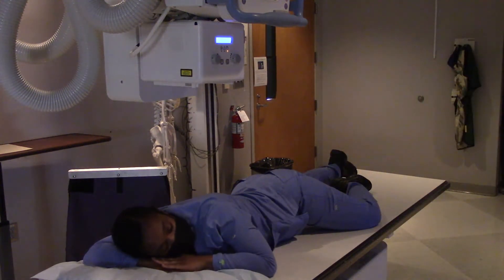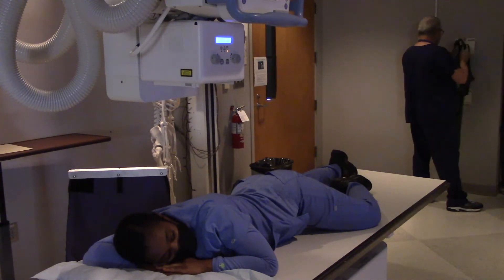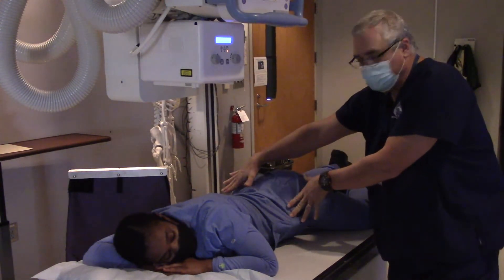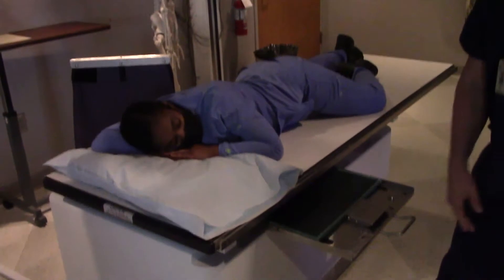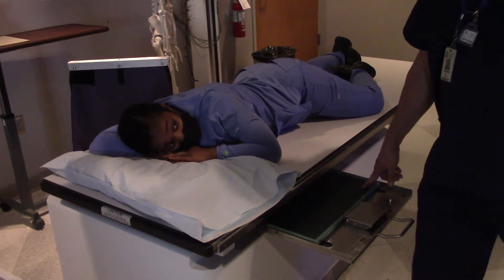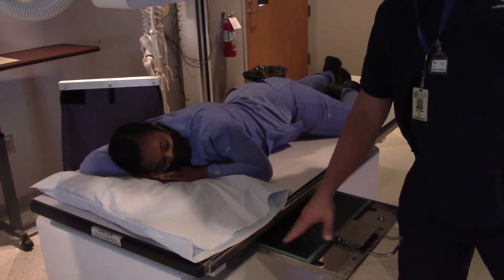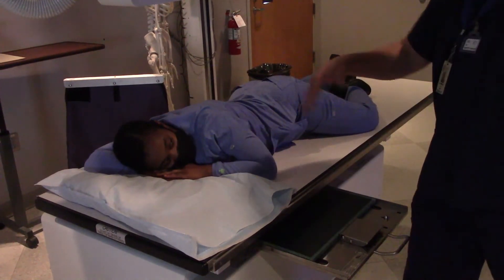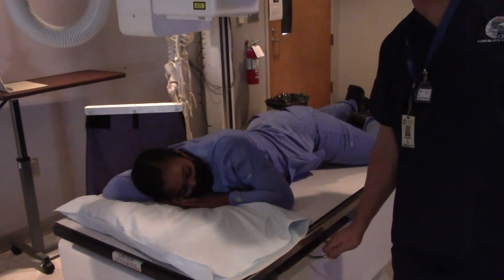Now, something that I forgot to do — I hope I don't get called out on this too badly — I need to shield my patient. There's no reason not to shield on this examination. The other thing I forgot to do is mark my film. Where should I mark my film? Should I mark it high or low? High. I'm going to mark my film high, and you can either put a left marker or a right marker on, just as long as it's anatomically correct. Usually we say mark the side down, which would mean a right marker here, but you could put a left marker right here because that's less likely to get lost in the bucky.